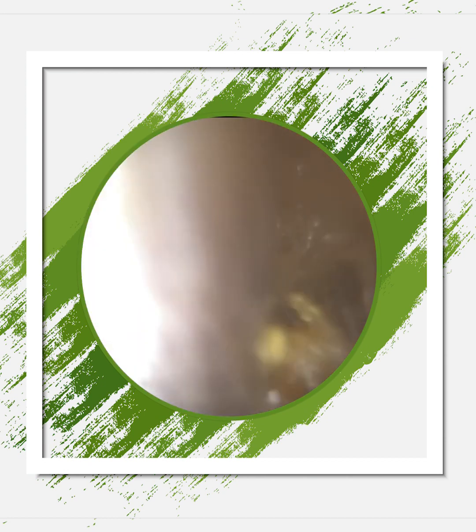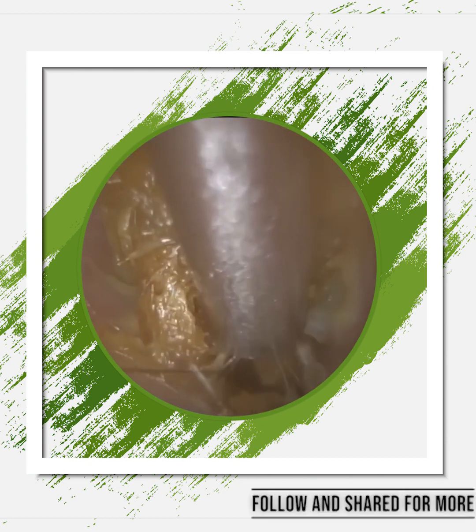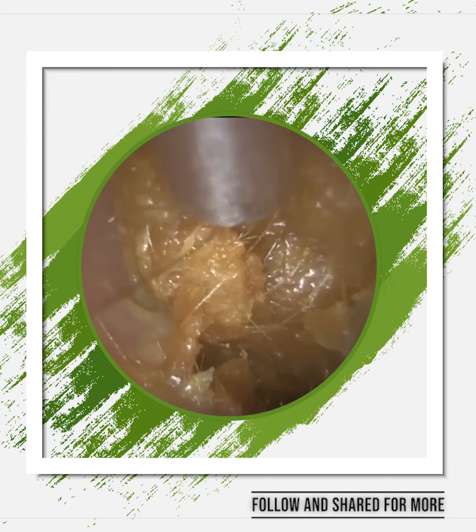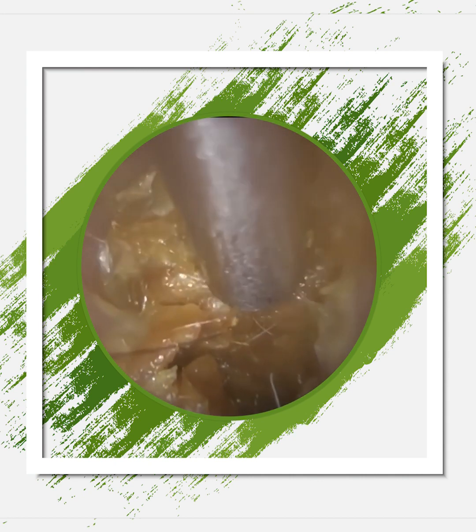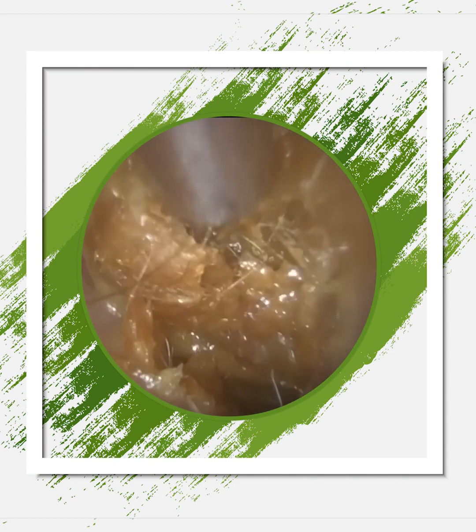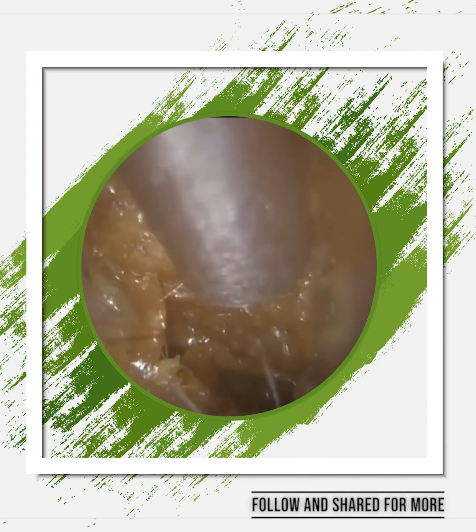And once I widen and straighten the ear, I'm then inserting the endoscope into the ear canal, just past the hairs at the entrance of the ear canal, and I'm then using the side of the endoscope to stretch the ear to the left to keep it ajar. And that's how we open the ear in the case of the right ear.